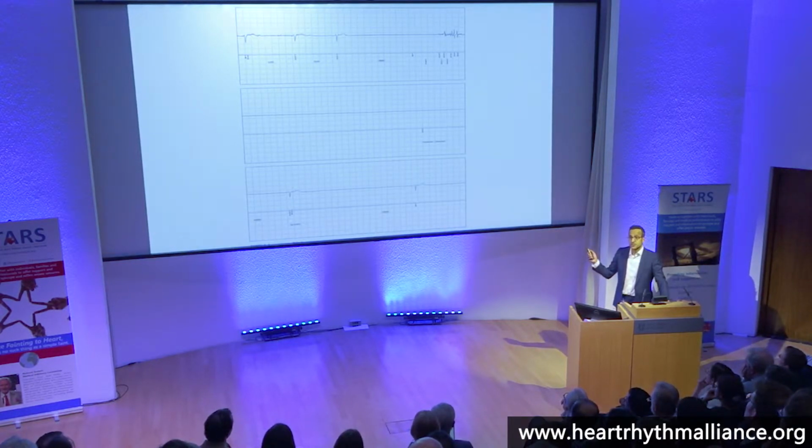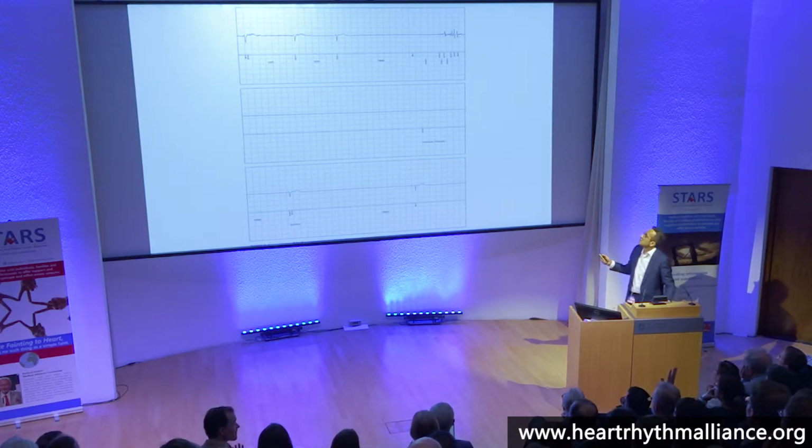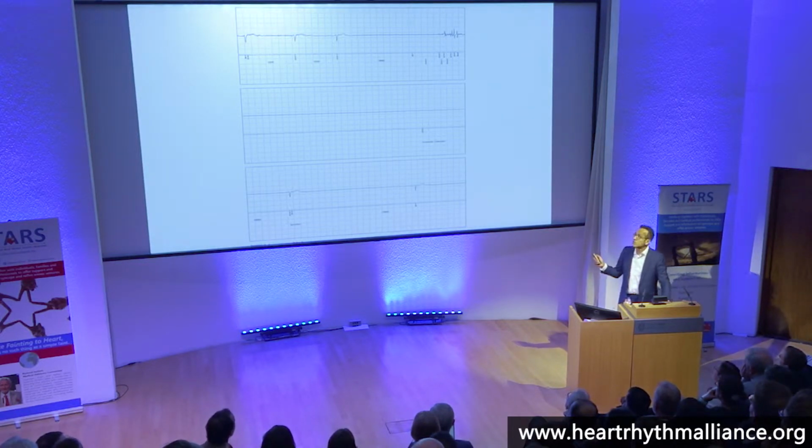So this is a 32-year-old, 30-something-year-old GP. Who'd pace him now? What time of day? This is during the syncope episode in the middle of the day. Okay. What's this? Yeah, that's when he hit the floor.